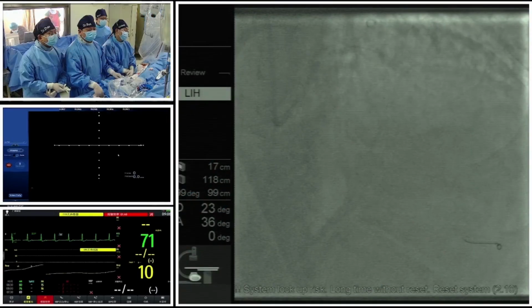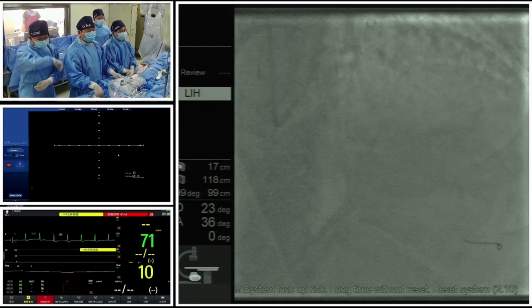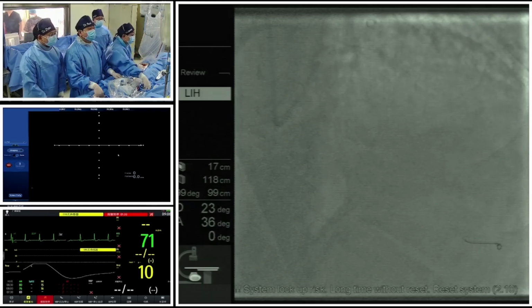It's a multivessel disease. There's severe stenosis in RCA and intermediate to severe stenosis in proximal LAD with lots of calcification. And there's also a clear fistula connecting the diagonal to the left ventricle. So we did the virtual stenting. It gave us some guidance on how to put the stents. So Dr. Gong, do you agree with the virtual stenting strategy? What's your thought on this patient?